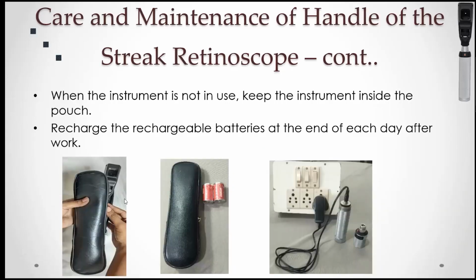And whenever the instrument is not in use, it should be kept in its pouch to keep it dust free. And also, if the handle has a rechargeable battery, it has to be recharged at the end of the day in a regular manner.